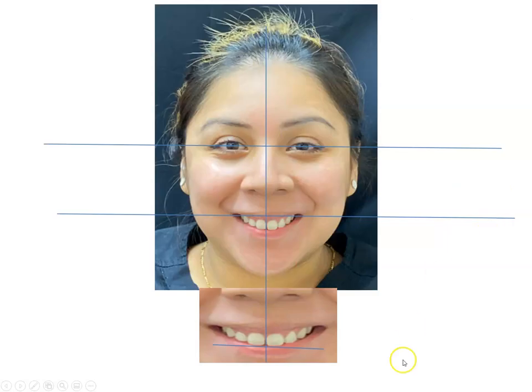And we're moving to our patient, and if we take a quick look at our patient, we see that she has a cant, and as this goes down, the teeth are all sliding down, canting, and we're going from the gums to the teeth. We know that they're slightly slanted to the patient's right side. What we're going to be doing is fixing her cant, and that's our goal. We know that the midline is correct, but her cant is shifted.